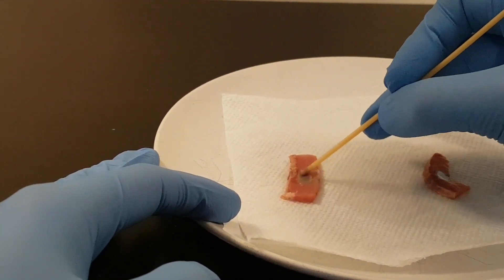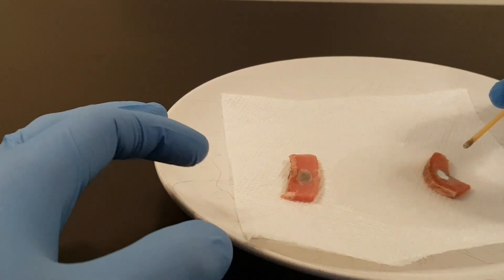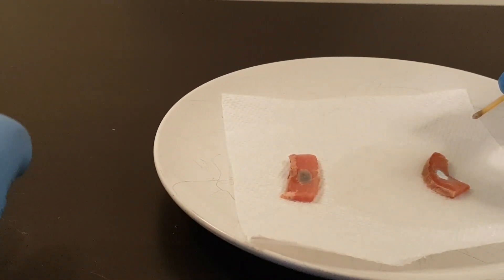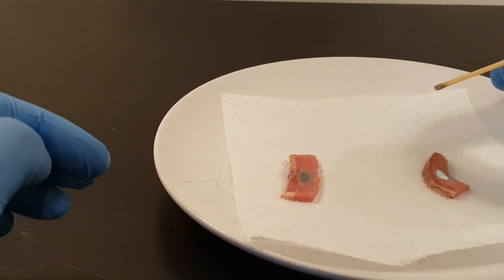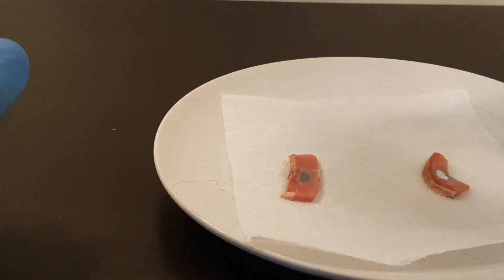I usually only do about two sticks and I give two to three days in between, because afterwards this is going to solidify itself and then slough off. The tissue underneath will be depressed a little bit farther. If you do it every day it's just more work, so if you let the body take care of things and give it every couple of days between silver nitrate treatments, it'll be much easier for you in the long run.